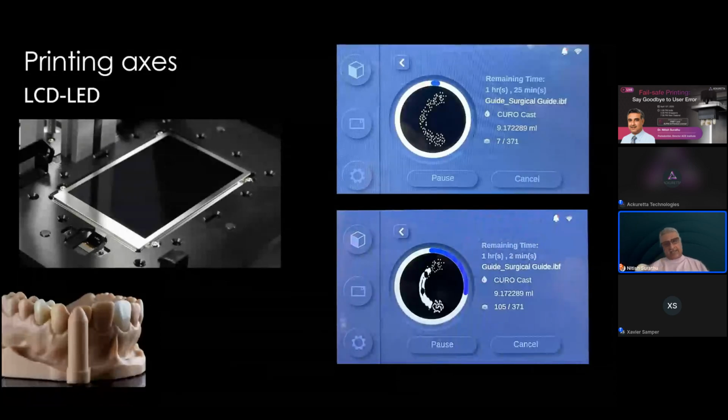Very smart. And this was how 3D printing was invented by Chuck Hull way back in the late 80s. And so you see this continual printing of layer upon layer upon layer, and each of these layers are piled up one after the other on top of each other, leading to what we call a 3D print. Quite correctly, this is called additive manufacturing.